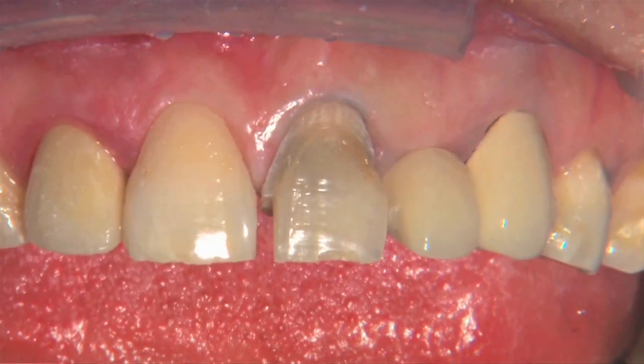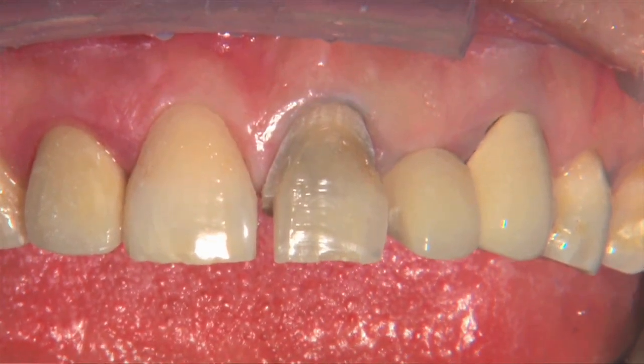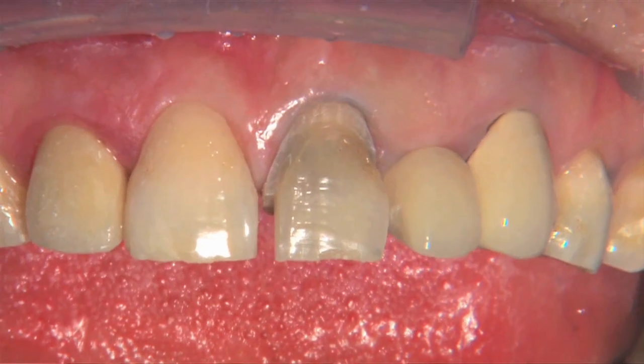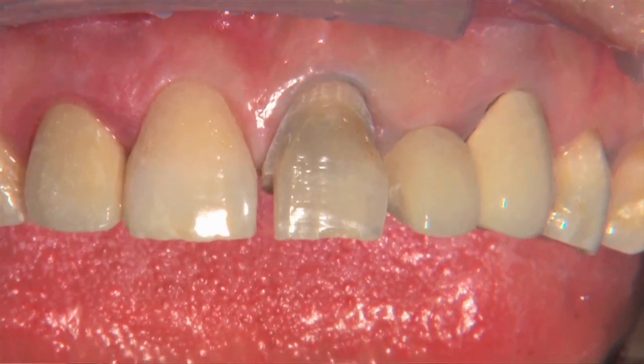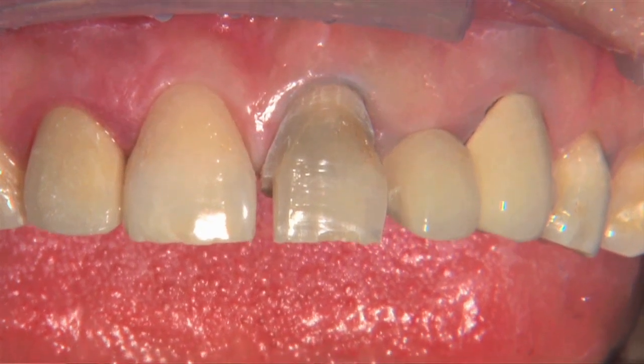Using this round diamond is the key to this technique, at least to getting the margin correct and getting it uniform on the facial and the lingual. So this round bur is really a great find. It was something that I found being used back in an old 1940s prosthodontic textbook, if you can believe that.